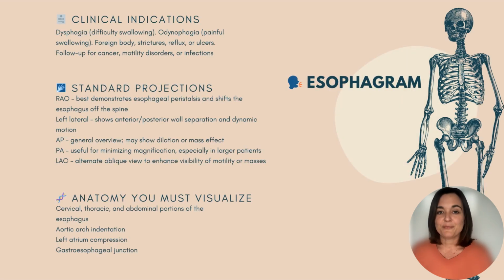Esophagram procedure. The esophagram or barium swallow is your go-to procedure for visualizing the structure and function of the esophagus. It's fast, informative, and can reveal subtle pathology if your positioning and technique are spot on. Clinical indications: dysphagia, difficulty swallowing, painful swallowing, foreign body, strictures, reflux, or ulcers, follow-up for cancer, motility disorders, or infections.